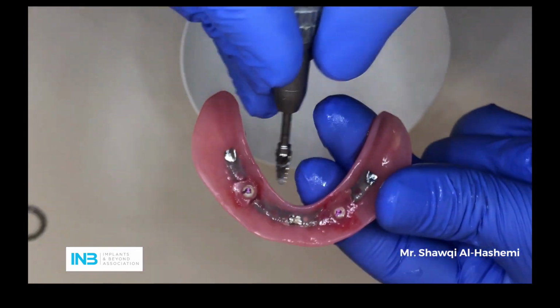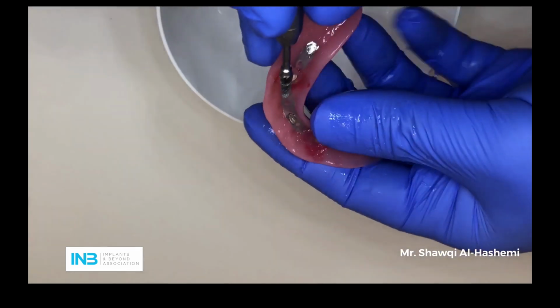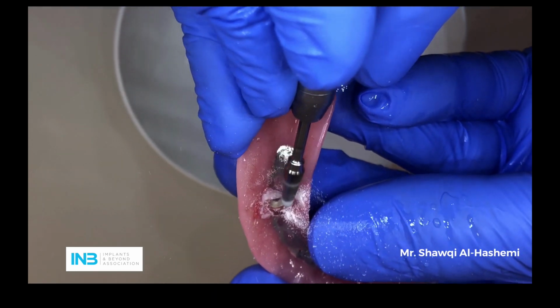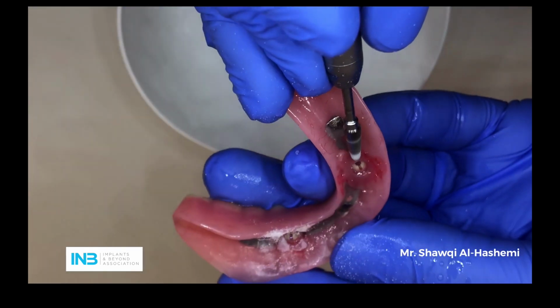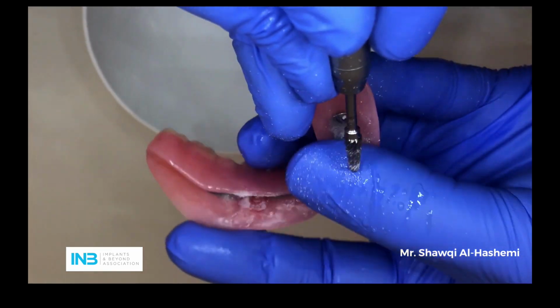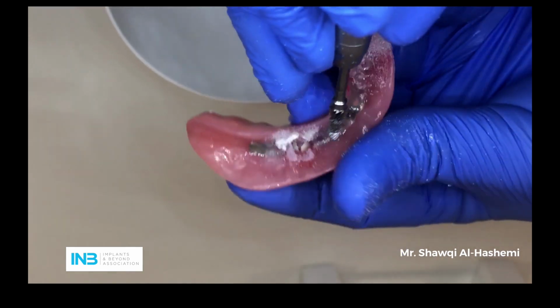As you can see, get closer please. This is a little bit of rough acrylic, which we're going to polish before you finalize it, because this is going to be really nice. Just remove any excess resin, because you want it to be smooth. You don't want any plaque retention, and the same thing here, otherwise it'll be uncomfortable for your patient. Then you use the polishing bar for the acrylic bit.